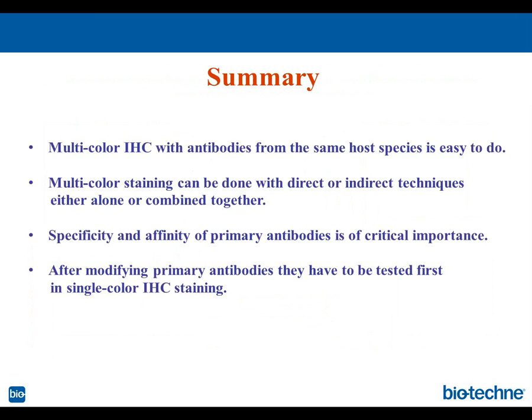Yes, we do. Antigen retrieval is done on all our antibodies when it comes down to testing and validation on human tissue sections. And this is a very good point. We also see it in our lab as well. The option here is to find better slides, I mean, slides which have better adhesion for the tissue sections. That's just trial and error, going through different vendors and seeing which slides from which vendor work the best.